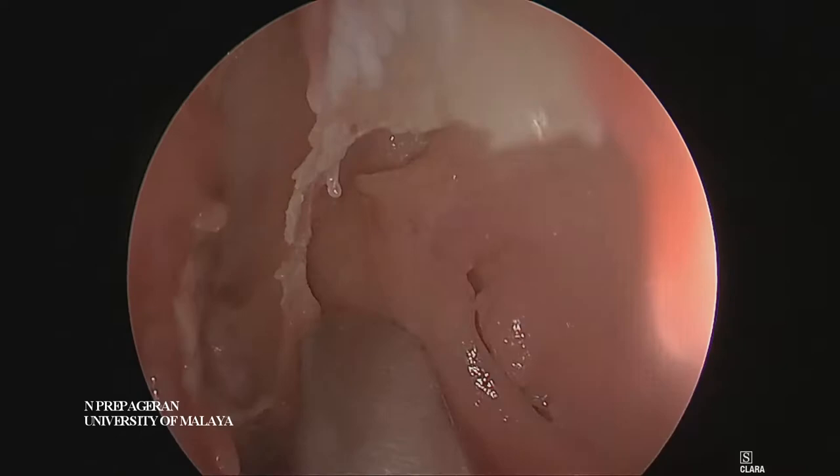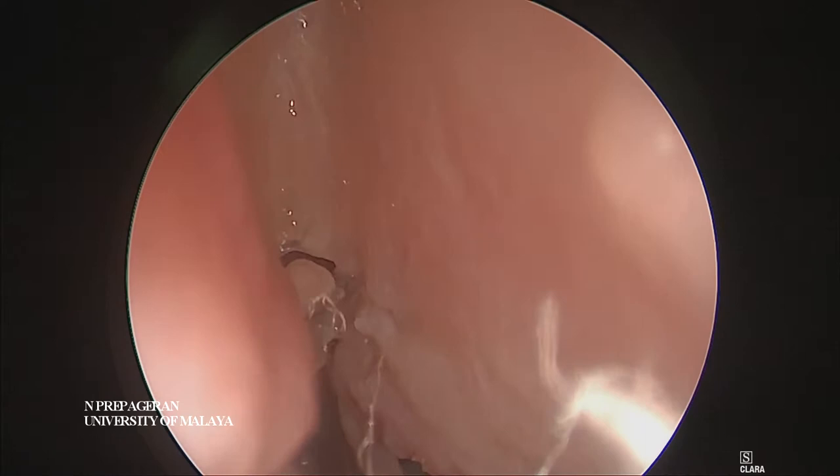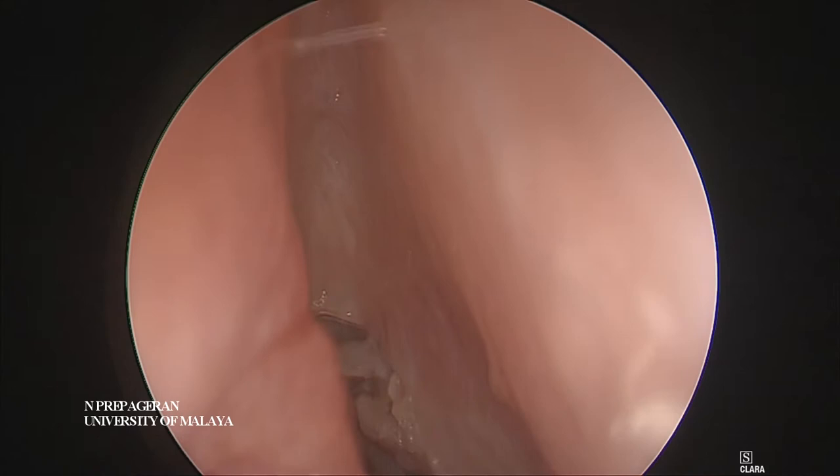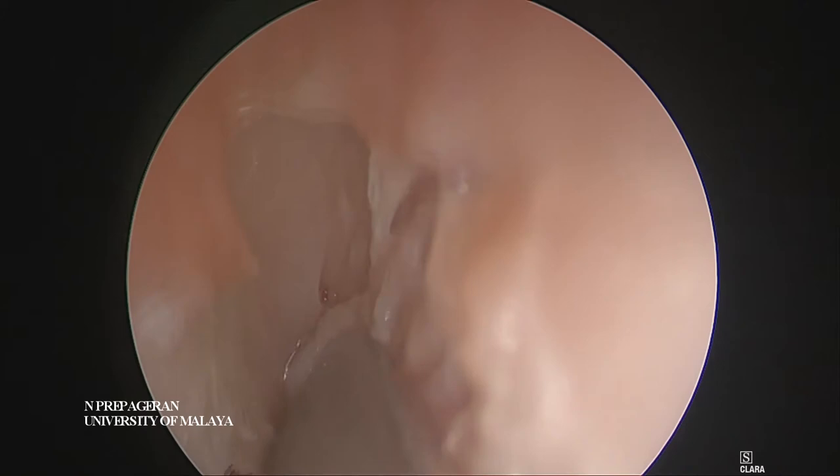You want to remove the mucosa backwards and cut this across here. This is not so easy simply because this patient has got a very badly deviated septum. The same way, you push this flat until you see the first olfactory neuron.